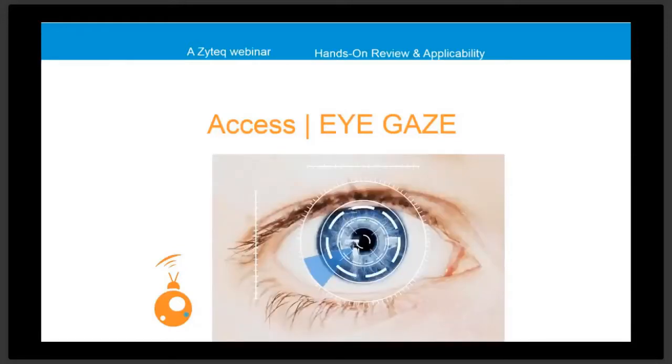People often ask which camera is best or which would be most suitable. The cameras these days are very sophisticated and they are quite similar in their technical specifications. The preference of one system over another may come down to unique differences in the physiology of the eye or individual differences.